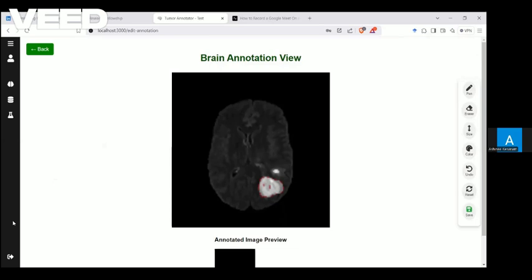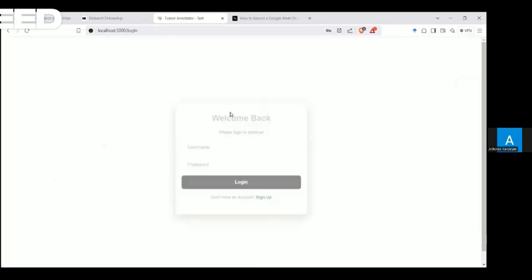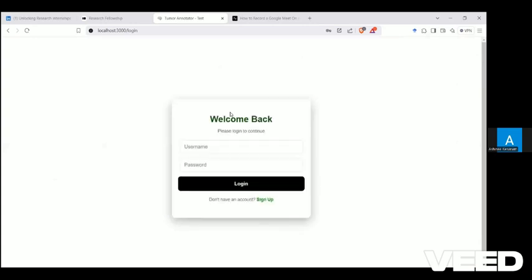So currently the file system is not properly well established, and our future aim is to establish it properly and store it in a cloud-based system. So that is one of our future goals. And also, as Priya mentioned, we would be having APIs to collect the recent new data sets or any sort of data sets and research related to the ongoing brain tumor related stuff. So that will be our future work in this case.